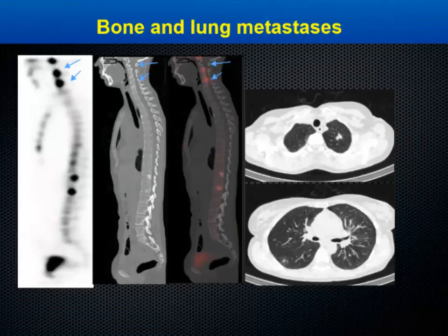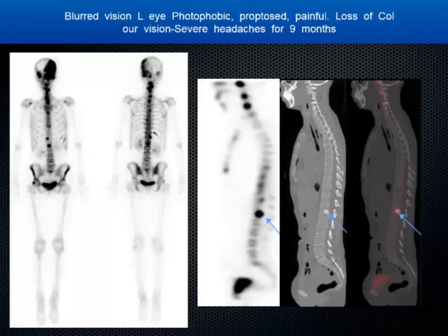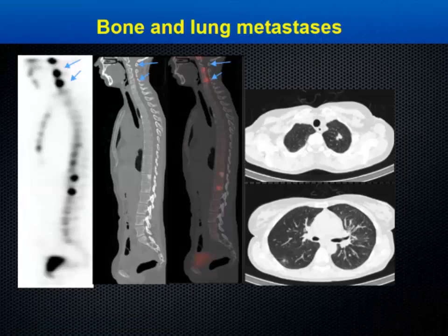But the only thing is we have yet to confirm the pathology in this. It looks like a malignant pathology, but we don't have a definitive diagnosis, and we are still waiting for the biopsy to see where the primary pathology is. She just walked in, a 37-year-old, working every day, and she had some blurred vision, and over a period of time she was losing color sensation. Then we did a bone scan, and this is the pathology, which is quite unexpected.